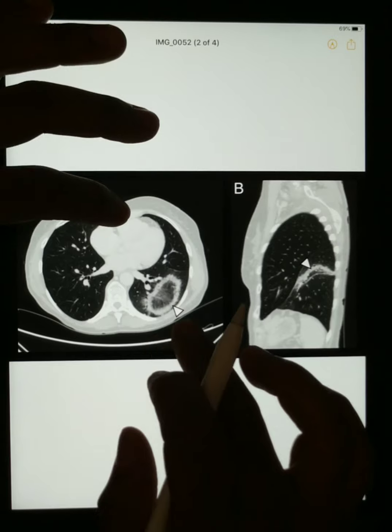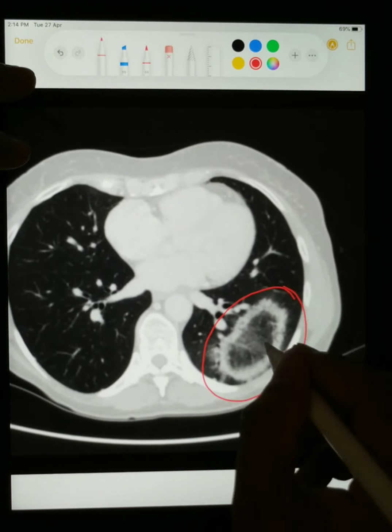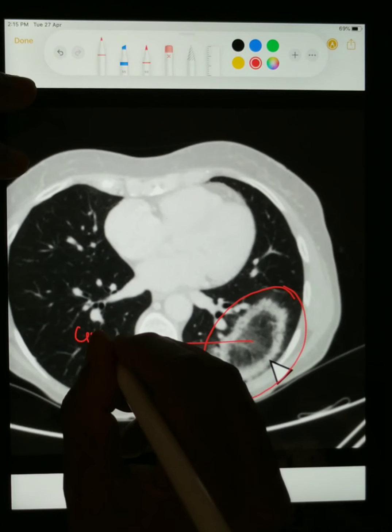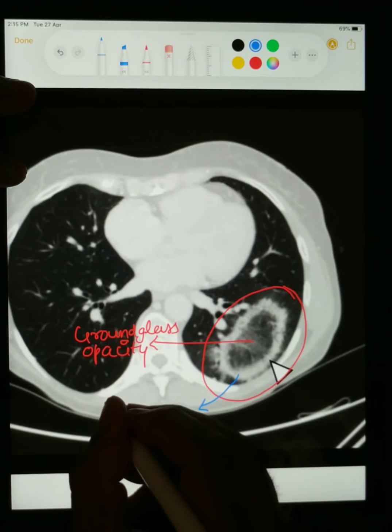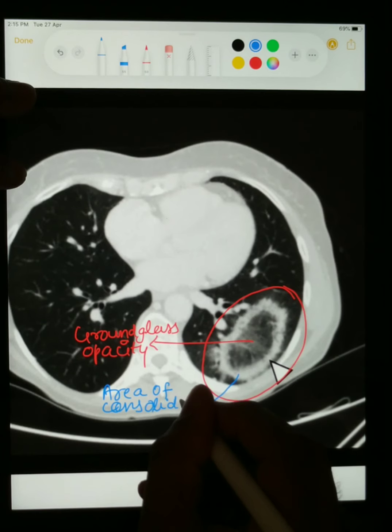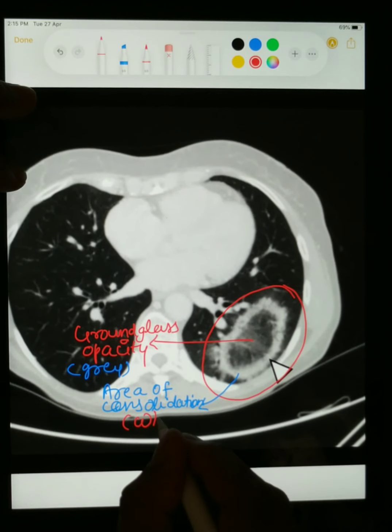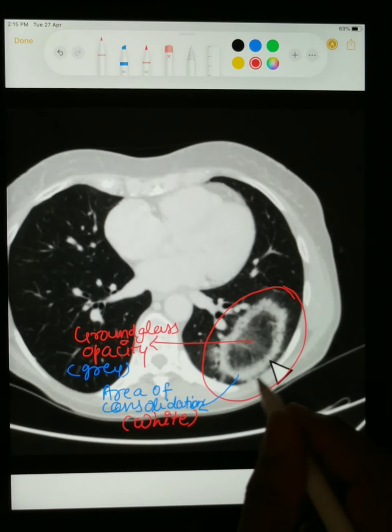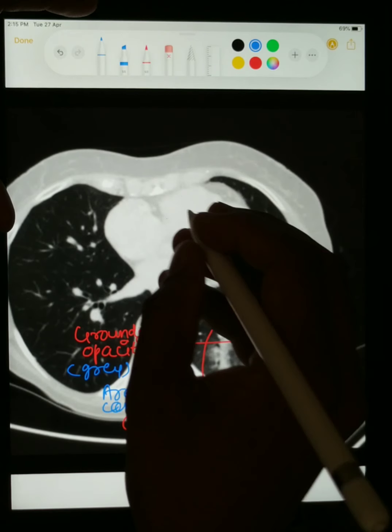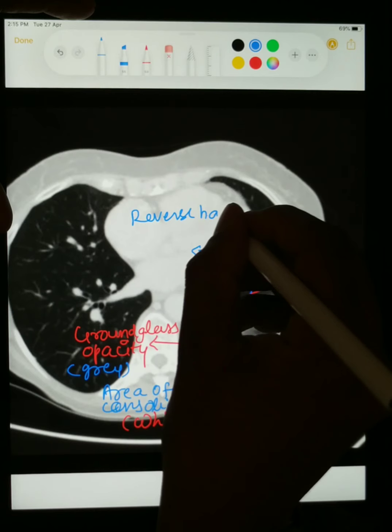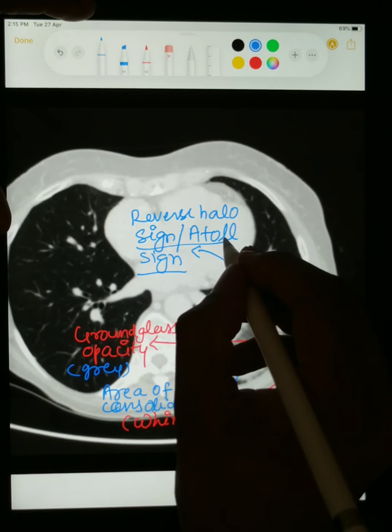Now the third picture of typical COVID-19 infection or atypical pneumonia. In this picture, centrally there is an area of ground glass opacity which is surrounded by an area of consolidation. So the area of ground glass opacity is grey and the area of consolidation is white. In any viral pneumonia or atypical pneumonia you can see this sign — centrally an area of ground glass opacity surrounded by the area of consolidation. This is known as the reverse halo sign or atoll sign, and it is also typical of COVID-19 pneumonia.